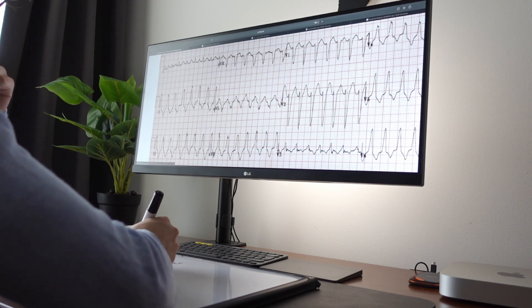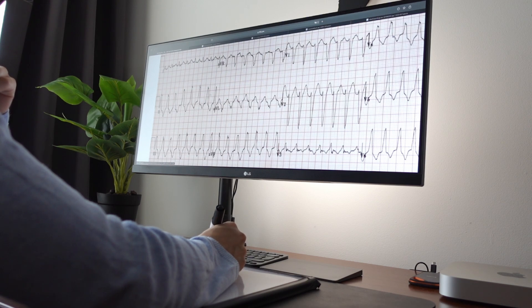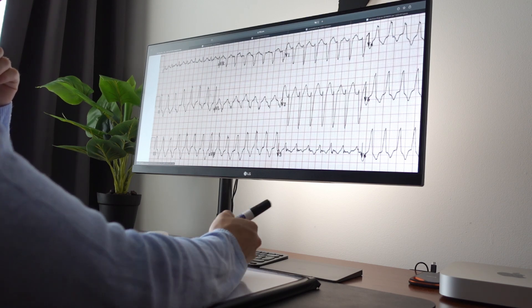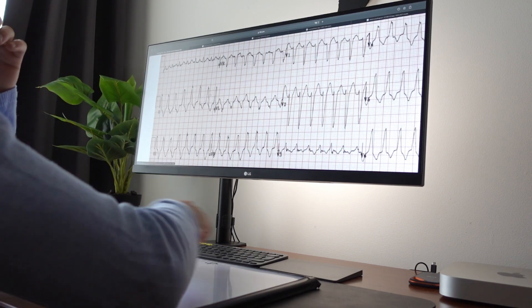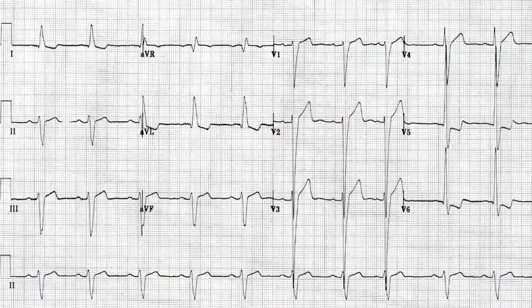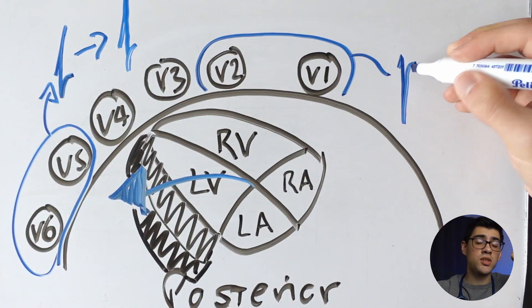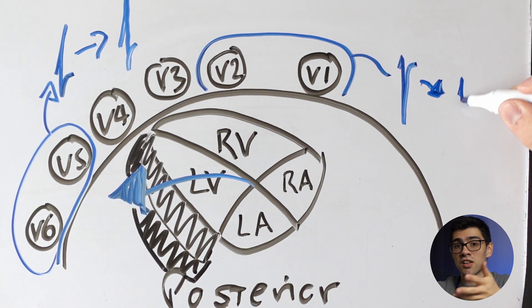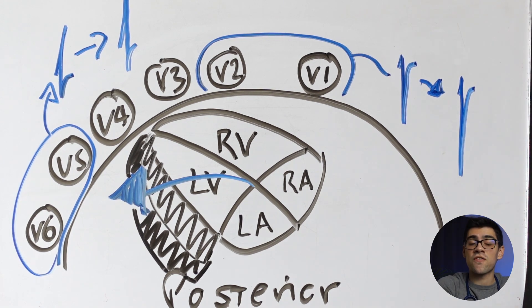For the waves, for example, you go lead by lead analyzing if there are P waves and if they are normal, then the Qs, then the R, then the S, then the T — wave by wave, lead by lead. Once you're done with that, you should have a list of findings, some normal and some abnormal, and it's just a matter of coming up with explanations for each one. For example, if you find high voltages in the precordial leads — particularly very deep S waves in V2 and V3 and high R waves in V5 to V6 — you already know how to explain those findings: it's the classical image of LVH. You just need to learn how to do the same thing with every other finding. It takes a little bit of time, especially at the beginning, but once you get the hang of it, it's not that hard. You really just need to know the common patterns, understand them well, and you'll have your way with EKGs.